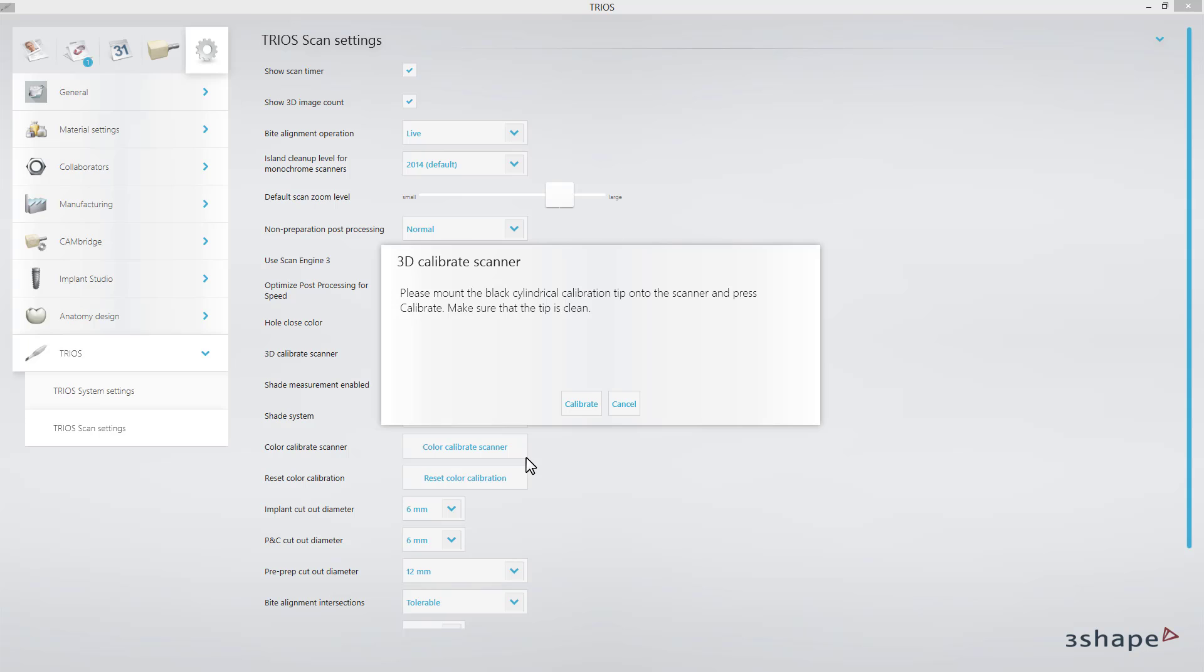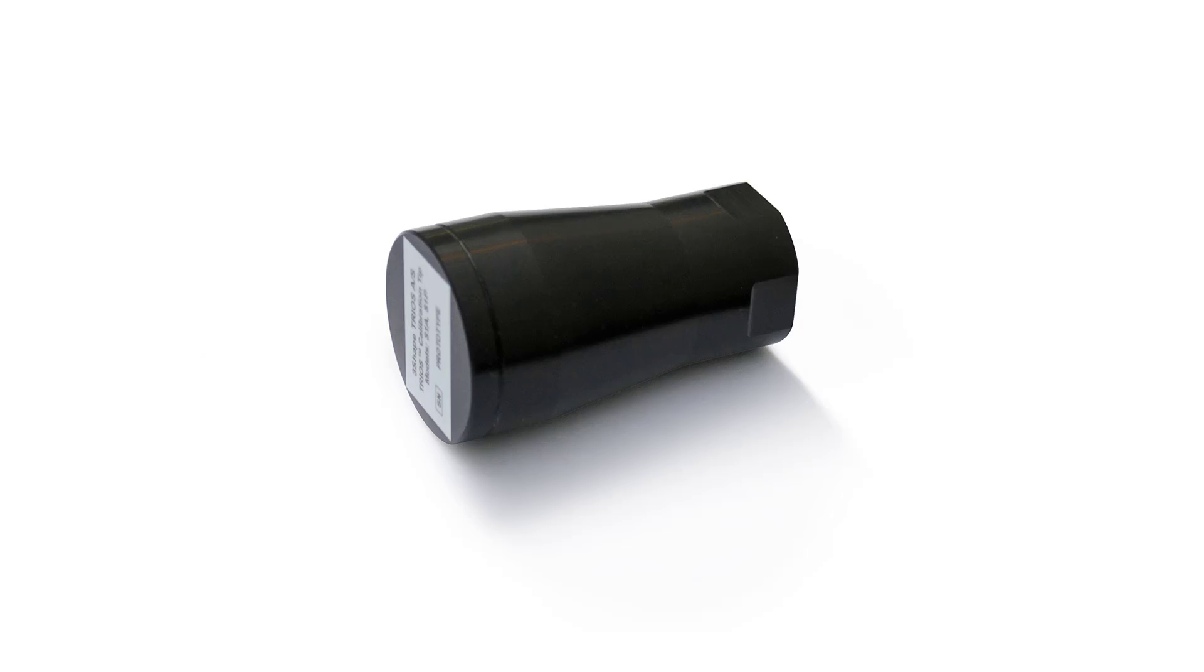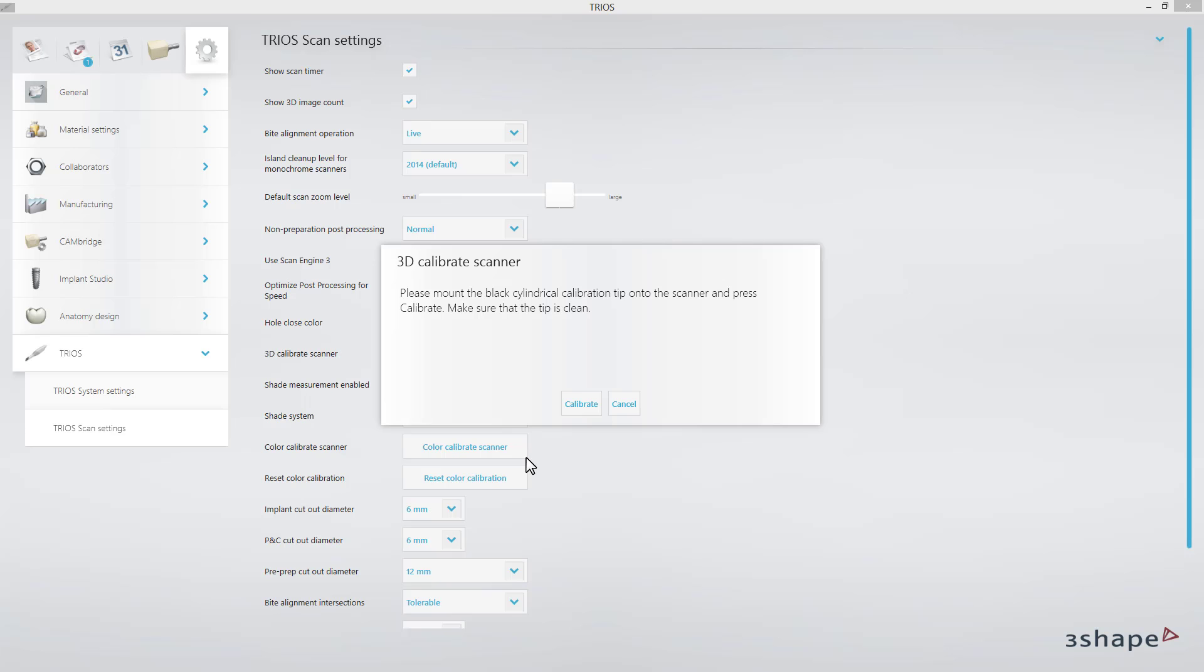Before proceeding, make sure that the front glass on the scanner, as well as the inner side of the calibration tip, are clean and free of dust or scratches. Mount the tip and proceed with calibration. It will take up to one minute.